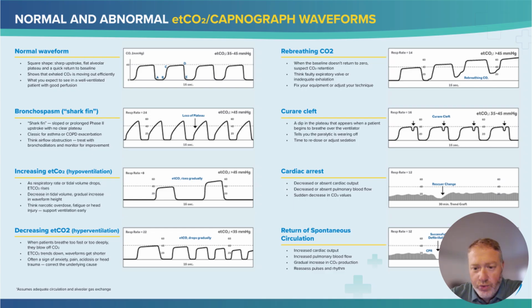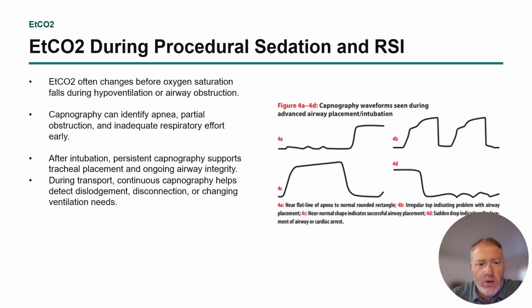Cardiac arrest, flat baseline, and then ROSC. I can't see because my face is in the middle of this one, but it should go flat and then boop, back up to a normal one. End-tidal CO2 during procedural sedation and RSI.